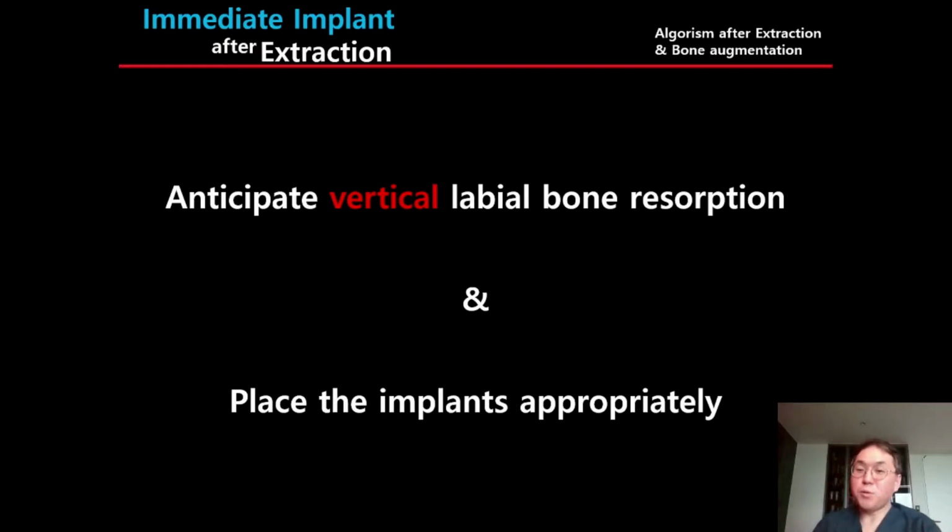But this graft material or bone augmentation procedure cannot prevent vertical bone resorption. So we should anticipate the vertical labial bone resorption and place the implant appropriately.